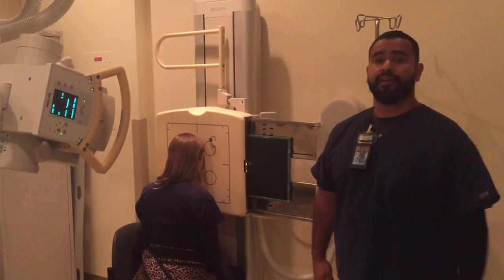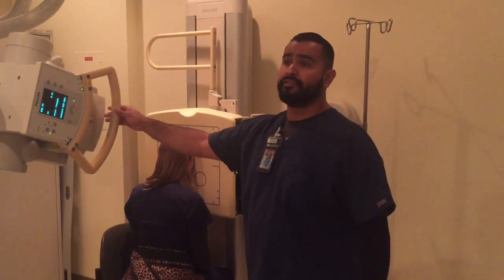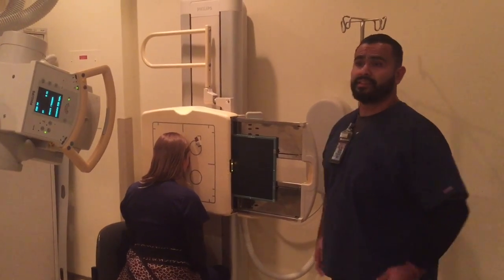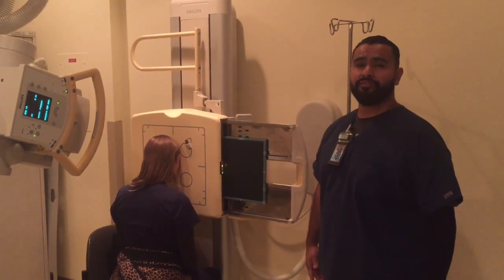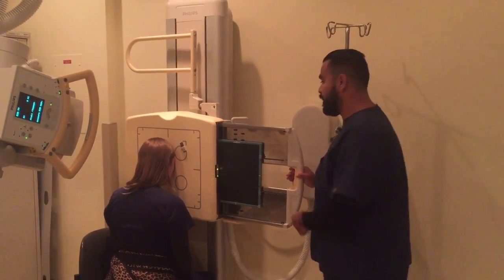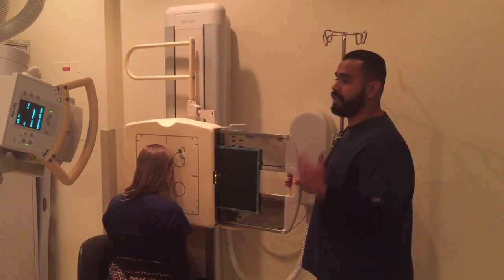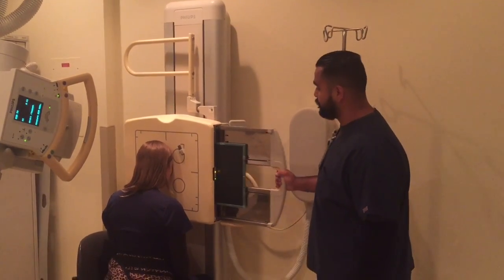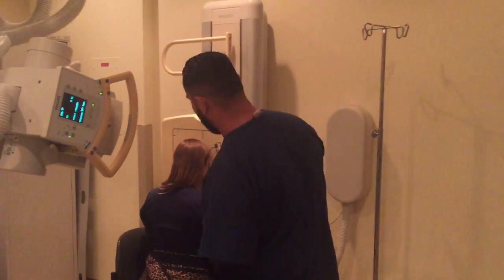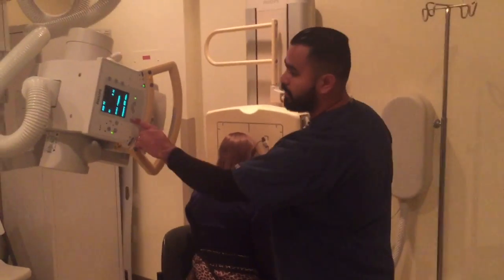So for my next image, I'm gonna have my PA axial Caldwell, and for this, I'll have my tube at a 15-degree caudad angle. And for the image also, it's gonna be about 85 kV, 14 to 16 mAs. I have my plate in a lengthwise orientation. Also, I have lead already on my patient.